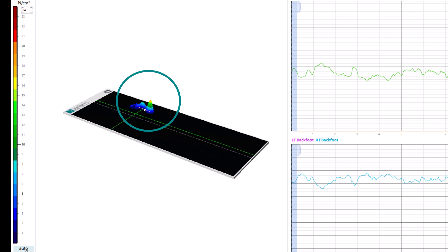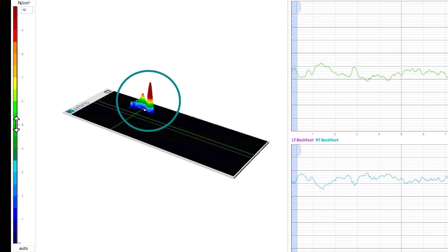As a third option, the pressure scale can be adjusted by moving the mouse pointer over the scale until it is displayed as a double arrow. Left-click on the scale and keep it pressed. By dragging upwards or downwards, the pressure scale is changed accordingly. Releasing the left mouse button fixes the pressure scale to the dragged value.